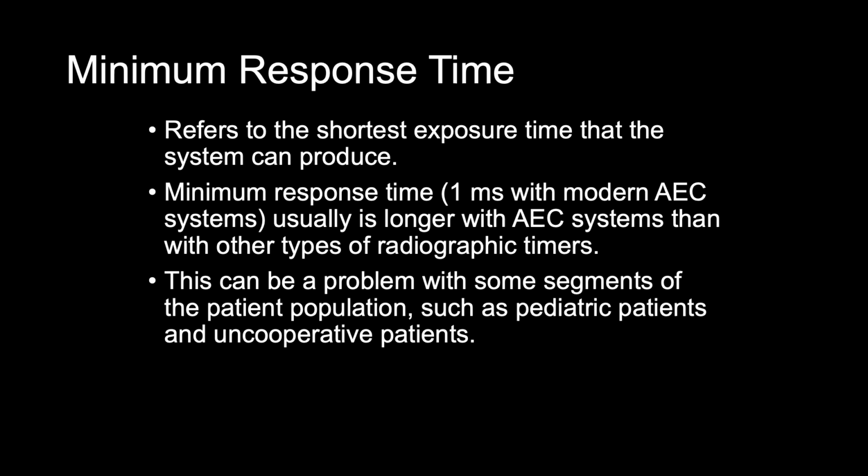With pediatric patients and others who cannot or will not cooperate with the radiographer by holding still or holding their breath during the exposure, AEC devices may not be the technology of choice, because we want to set our exposure time very short so that it won't allow them to move.